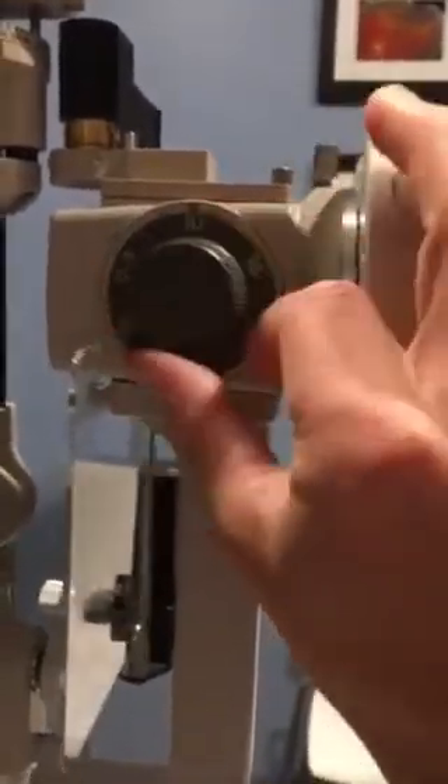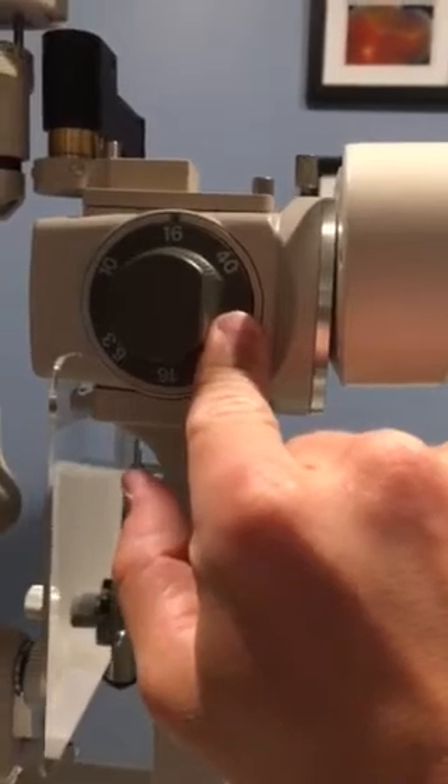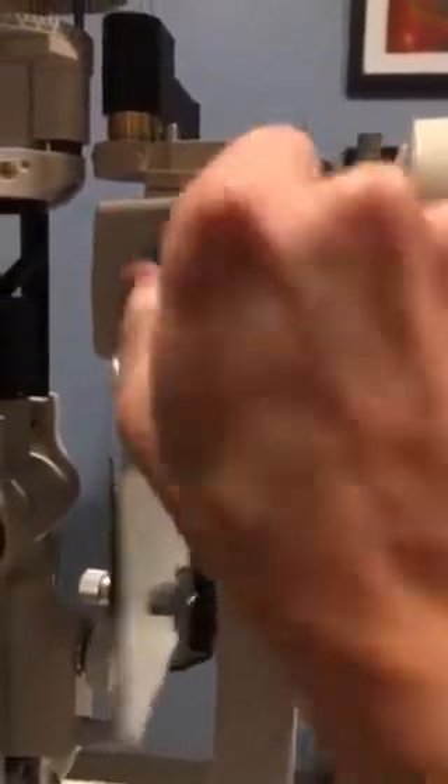6x, 10x, and 16x are the ones that you're going to use the most for just general looking at the cornea. 40x you'll never use, don't worry about it. 25x, if you're good, you may use. But generally 16x and 10x.